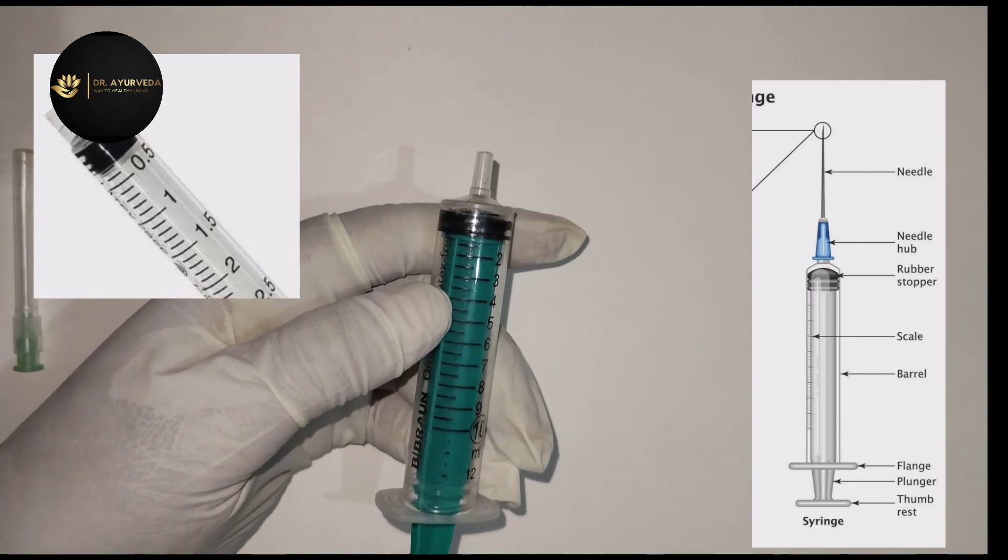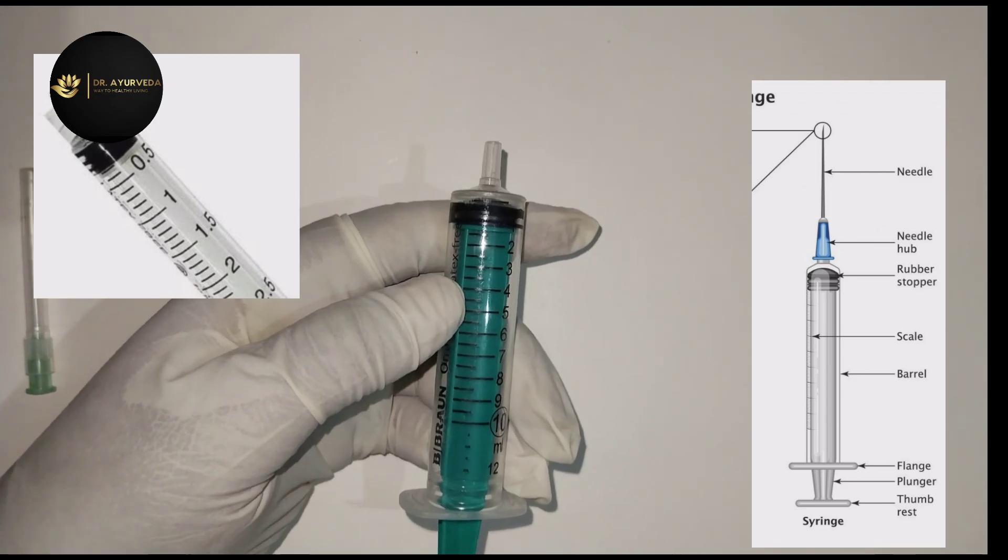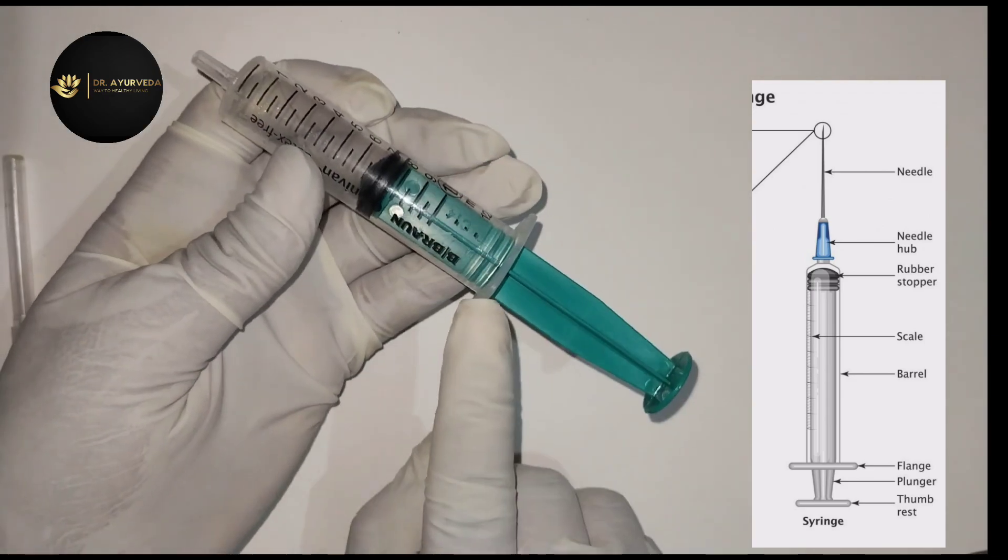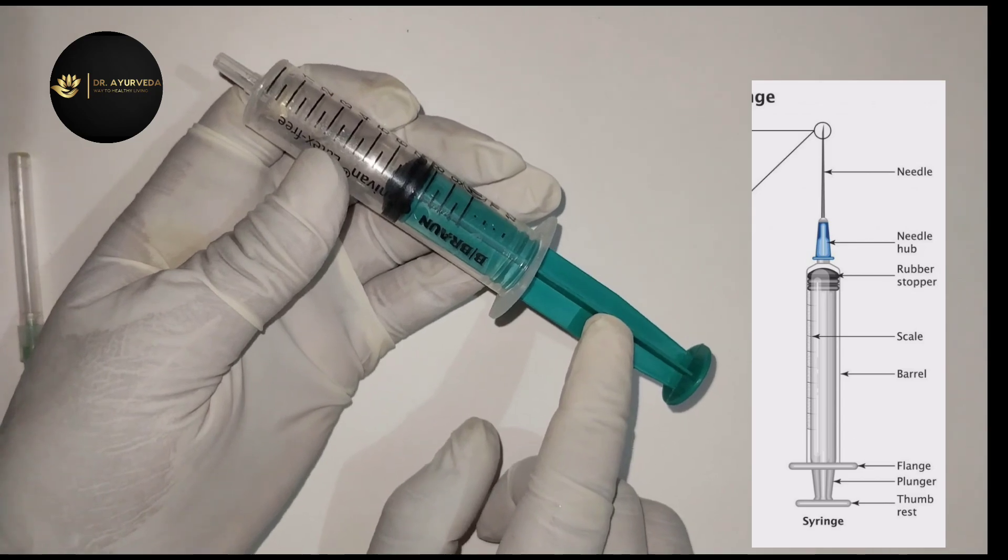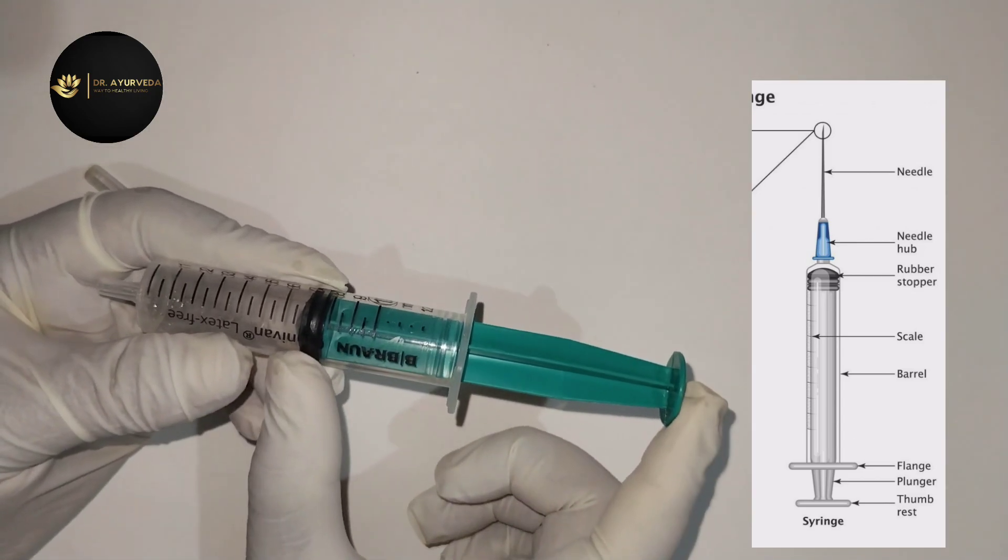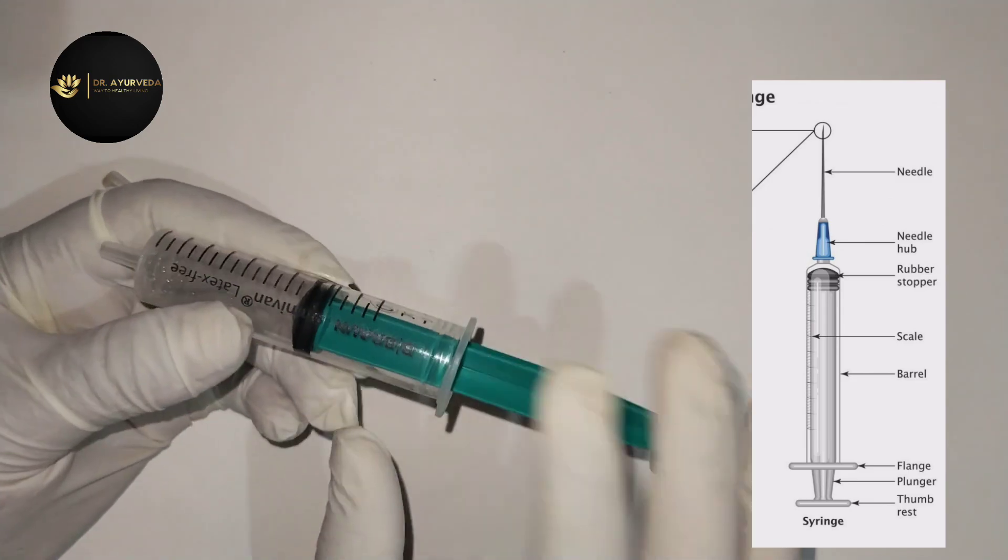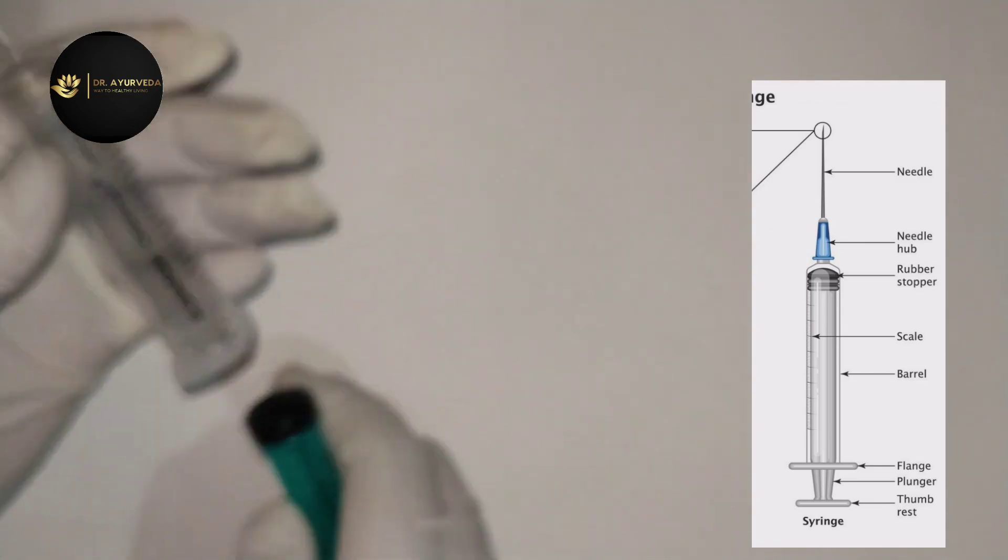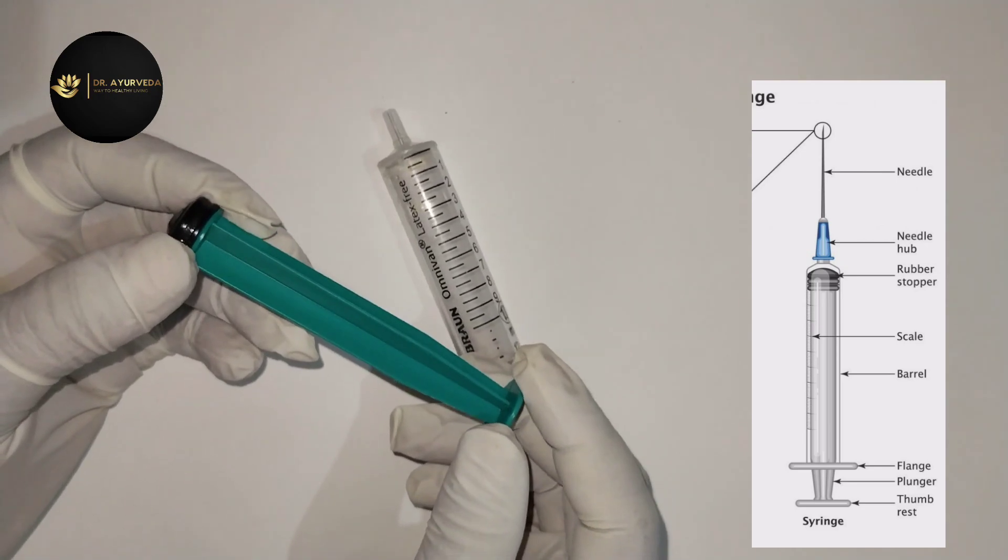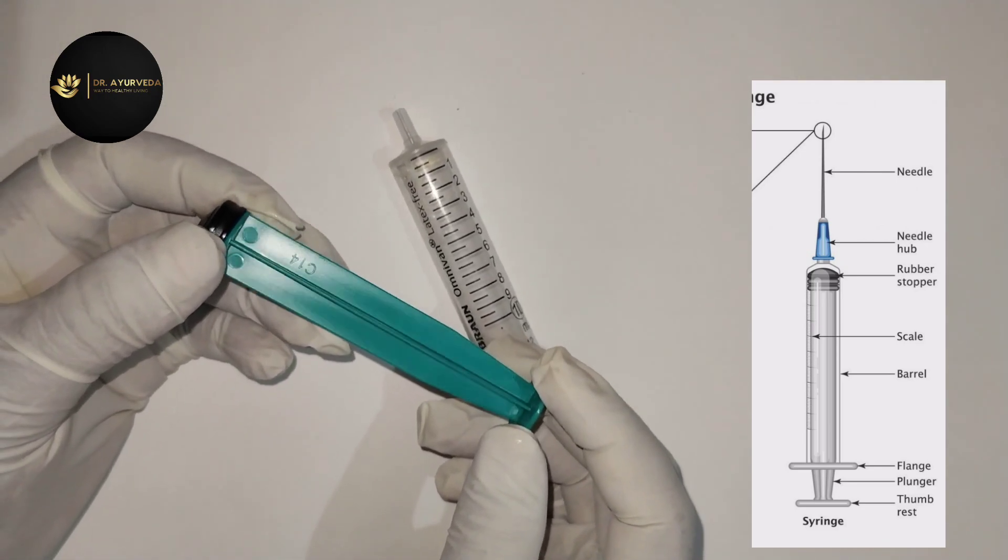Then you can see this area in the back. Here is the green area and here is some black area. This total part is called plunger. If we talk about plunger, there are parts of plunger.